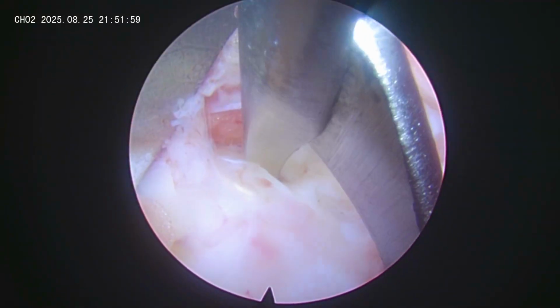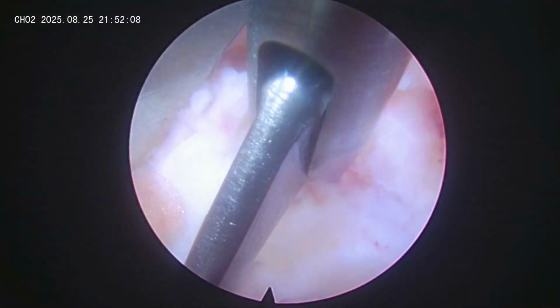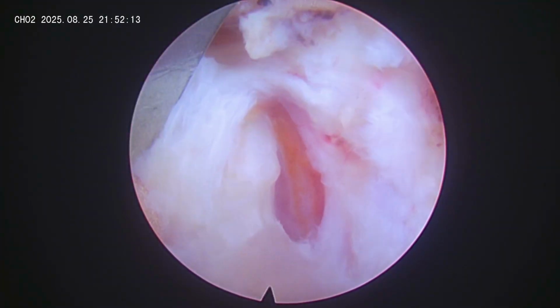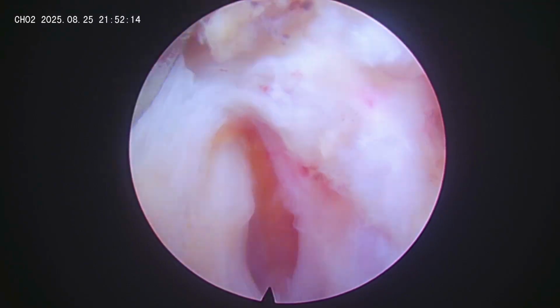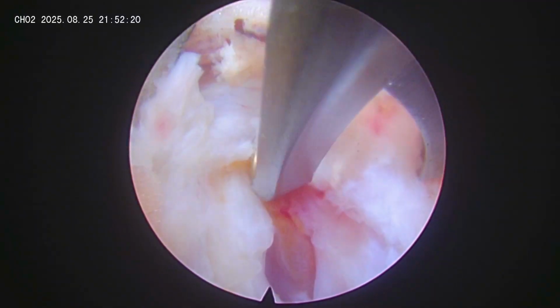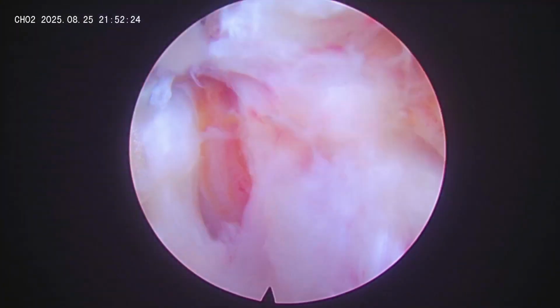The last and I think the most important finding in this patient: the moment I cut the outer annular layer, you can see here there is vascular granular tissue filling the annular defect. This is inflamed tissue which keeps leaking inflammatory mediators, which irritate the traversing nerve root, and that again explains the chronicity and the severity of the symptoms in this patient.